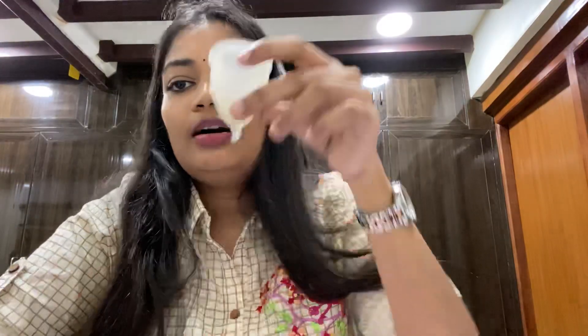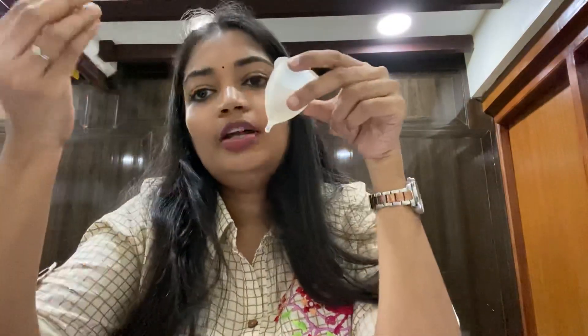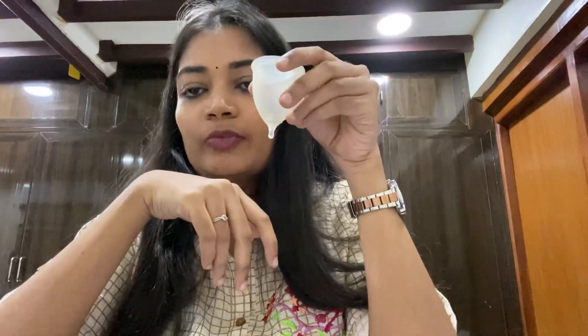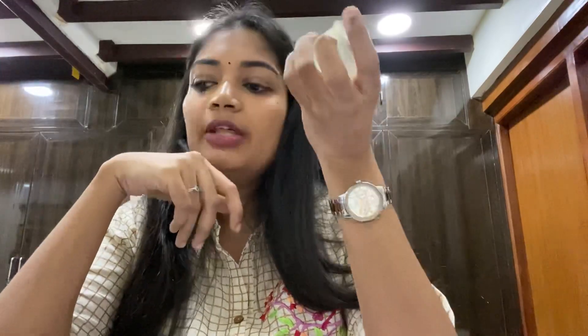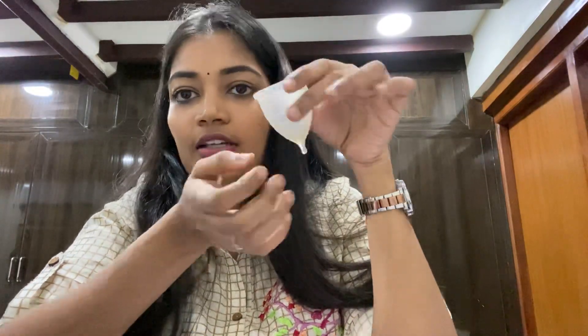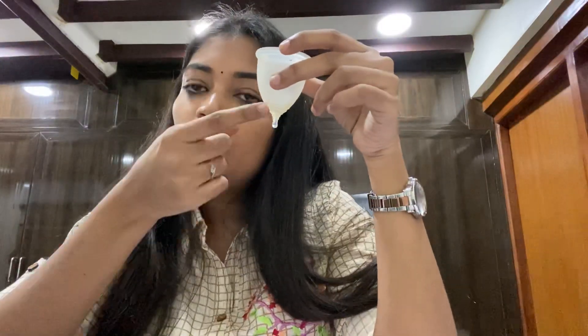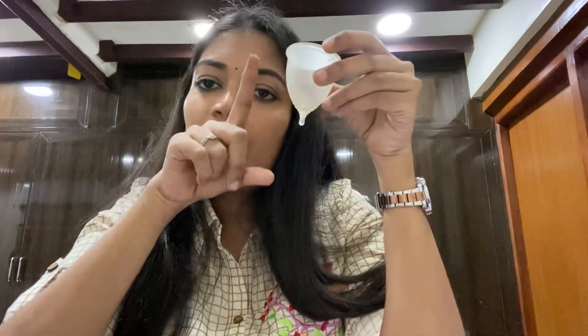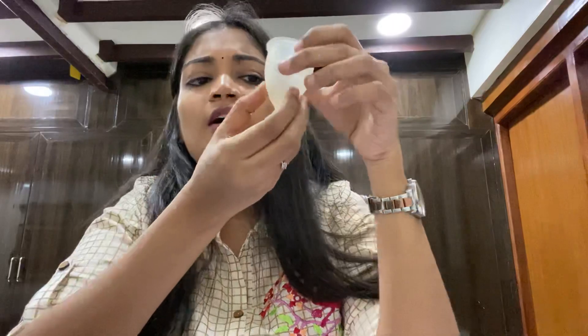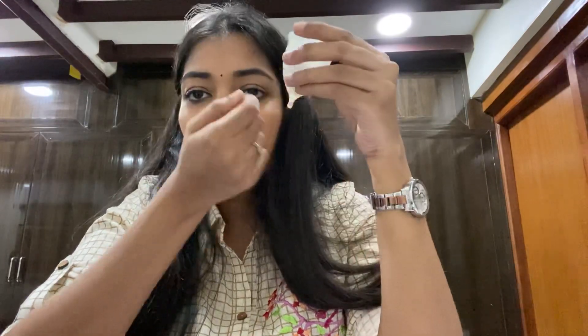The menstrual cup can be used by girls of all ages up to menopause. It comes in different sizes. During your period, you can use it for 8 to 12 hours before emptying. The cup has markings at 7.5 ml and 15 ml. It also has a stem at the bottom.